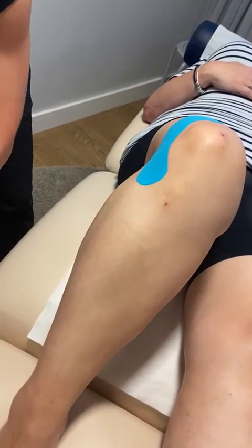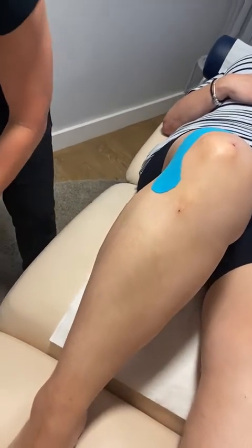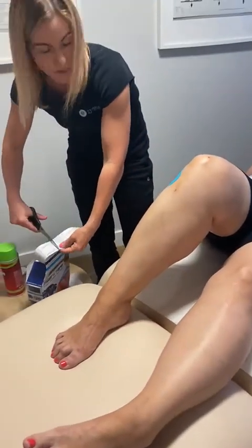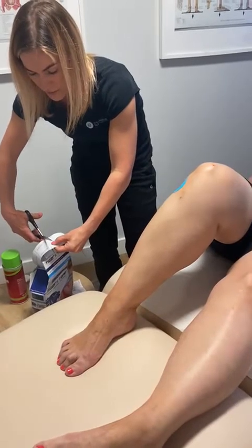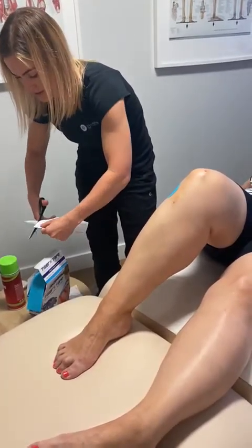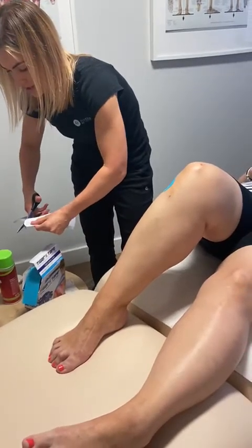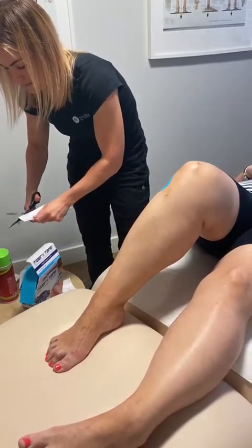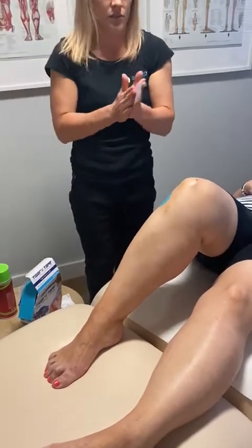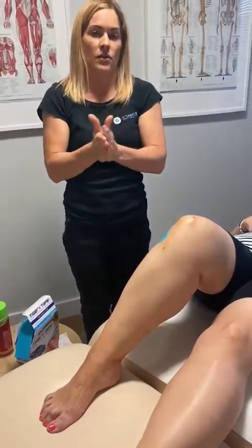We're gonna cut a second piece. So the first one was three squares long. It's going to be a bit longer, so 1, 2, 3, 4, or 5, depending on the length of your leg, okay? So if you're a bit taller, obviously you need to have a little bit more tape. Again, we're going to round the ends, just so that they don't catch, and it'll help it stay on longer. And again, you can use the adhesive spray if you want to. We're going to warm up the tape between our hands.